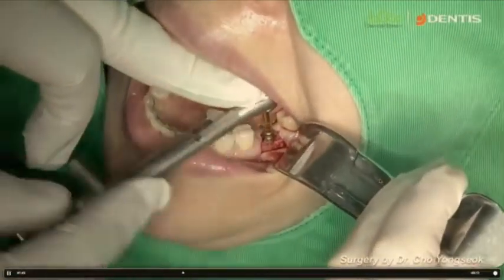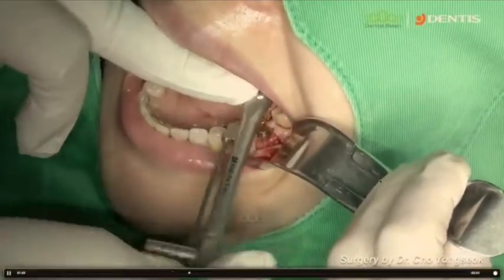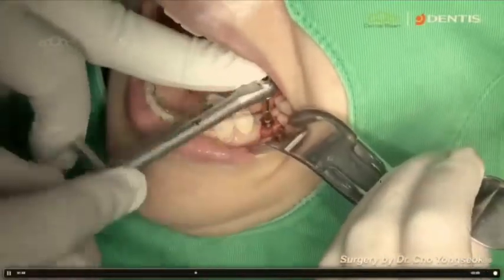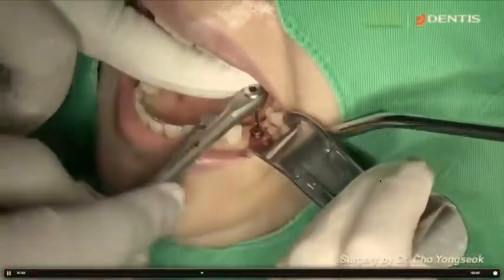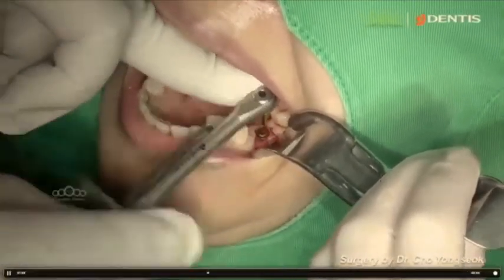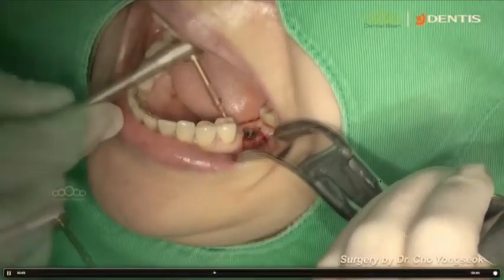Why did I place the extra short implant in this patient? I believe in extra short implants completely. And I feel that when we place an extra short implant, it's better than a long implant when we need to control any kind of problem.